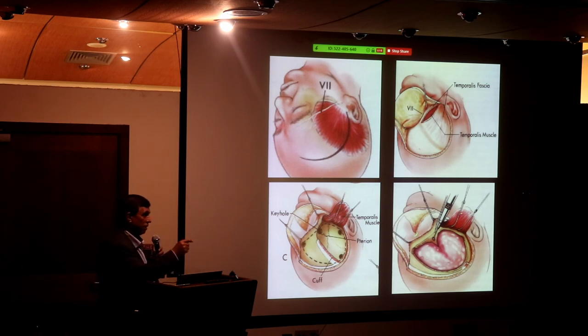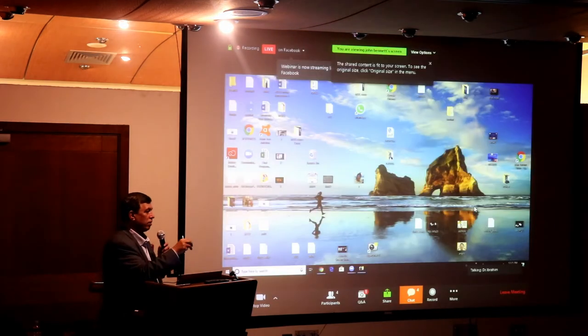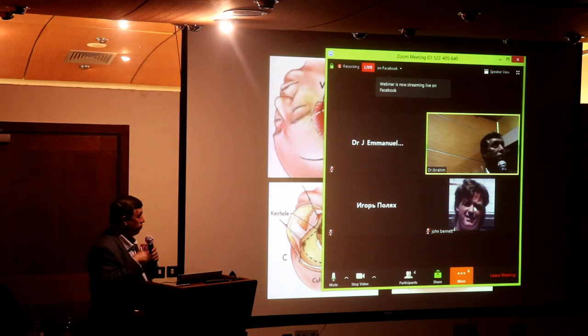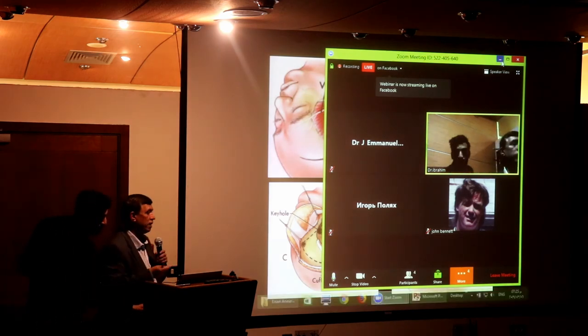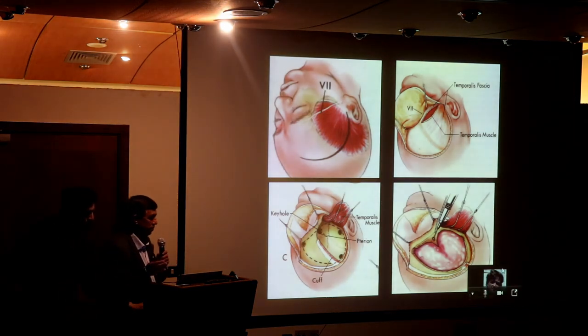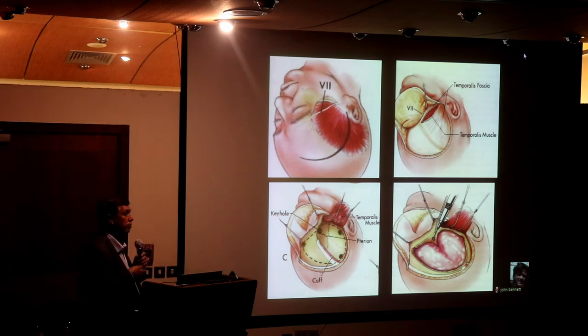Now your duty is to neutralize that aneurysm before it ruptures again. And CSF around the aneurysm has this ability to dissolve blood clot. So you need to operate quickly, immediately. The quicker, the better. And if you take the patient to theater, his aneurysm may rupture at any time: on induction of anesthesia, during opening the flap, during manipulation, etc. So you have to be prepared.